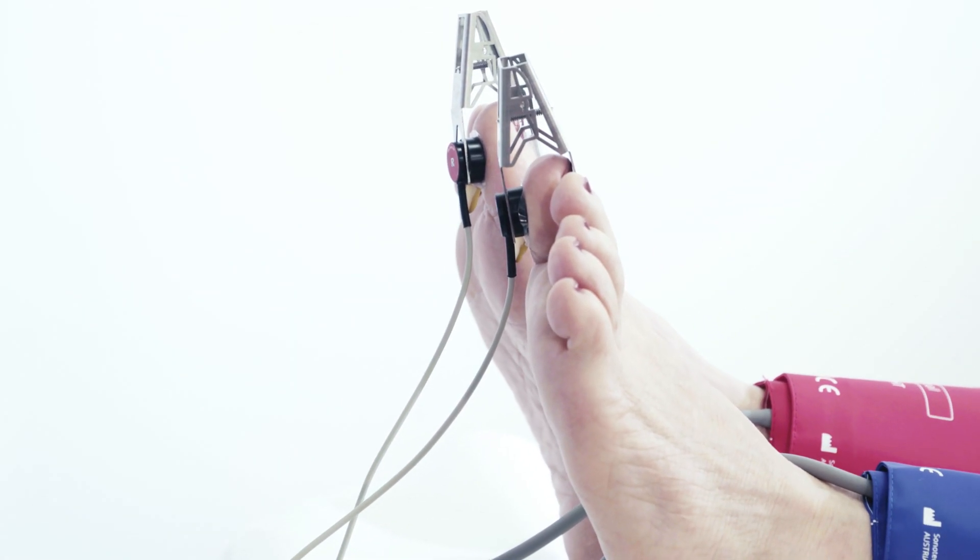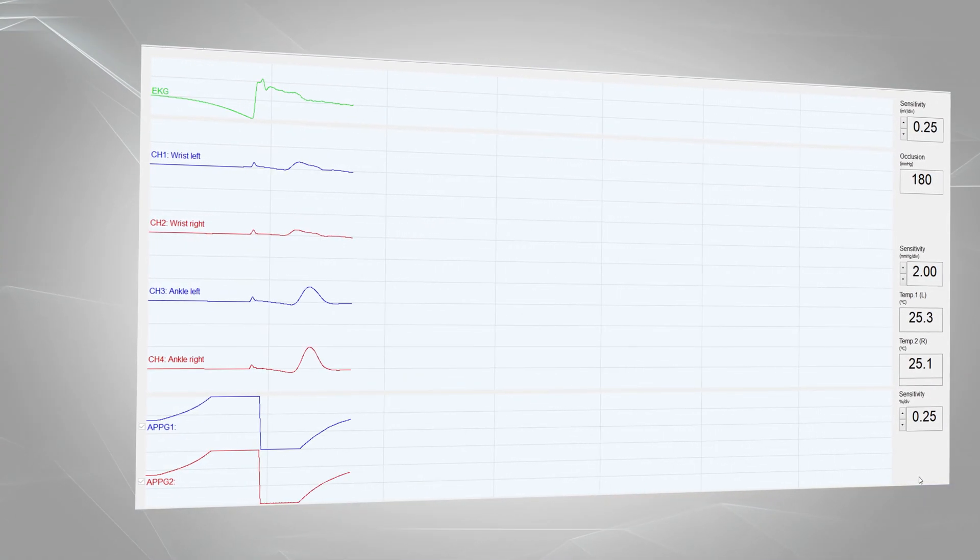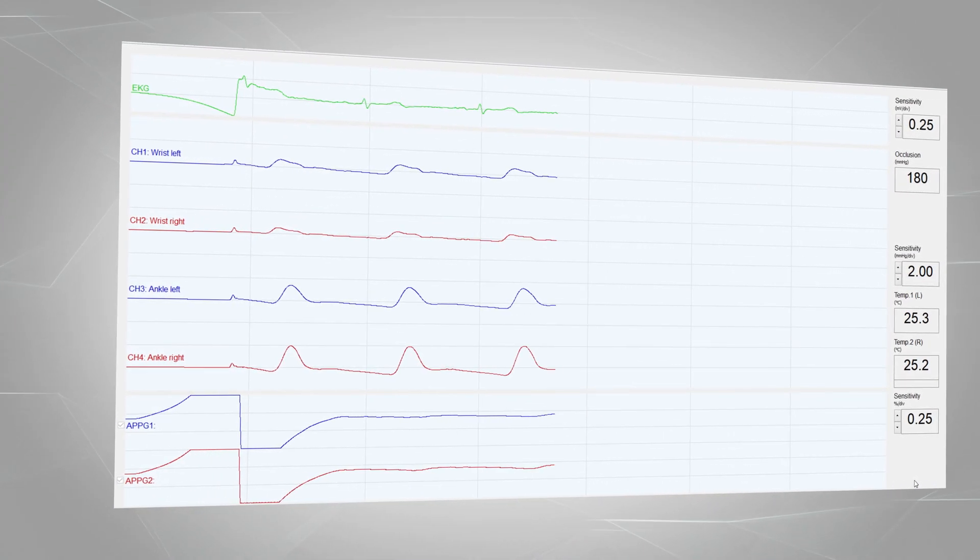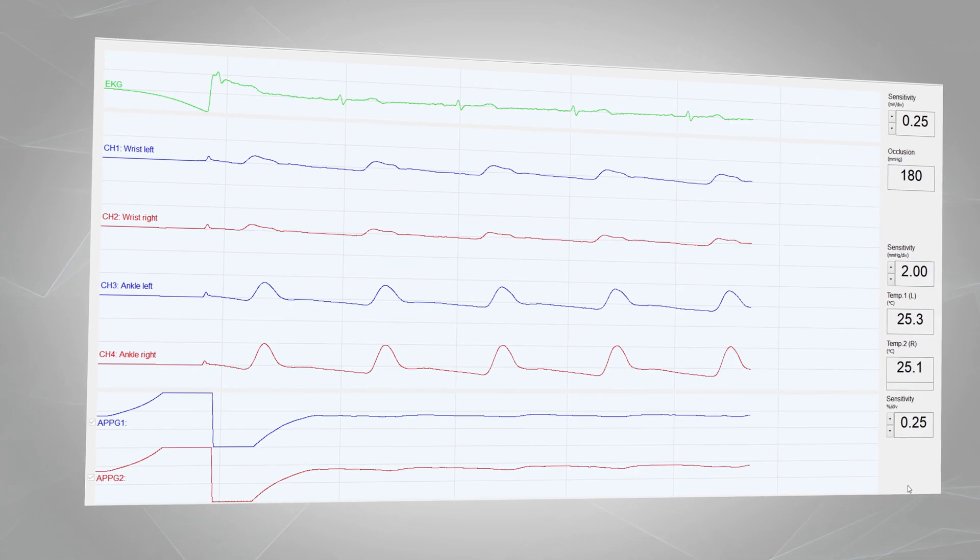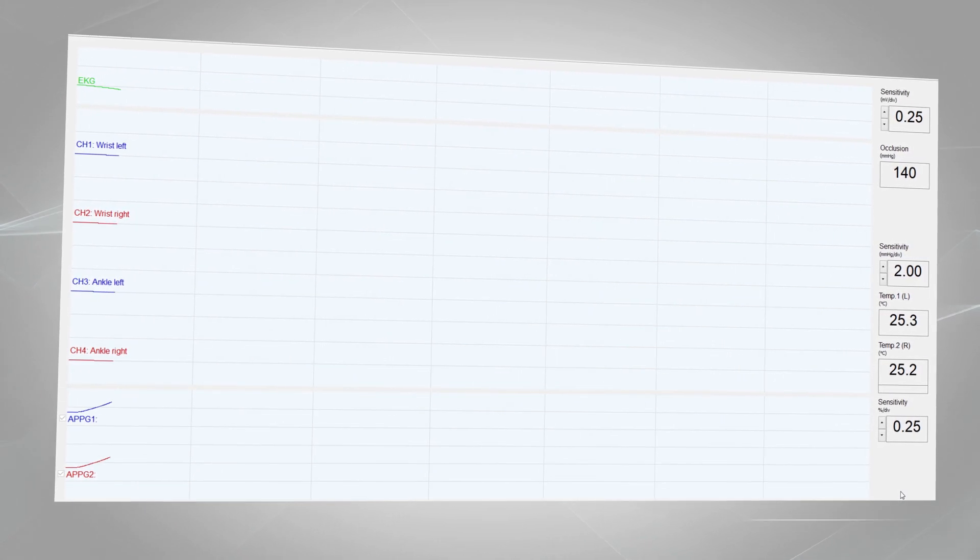the cuff pressure is increased by the measuring program to 180 mmHg and gradually reduced in steps of 10 mmHg.